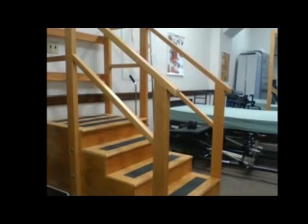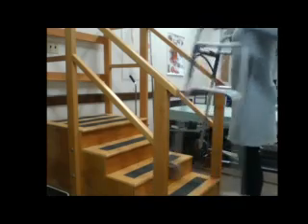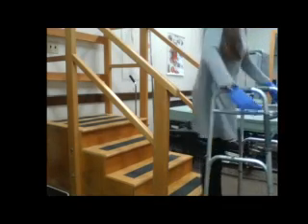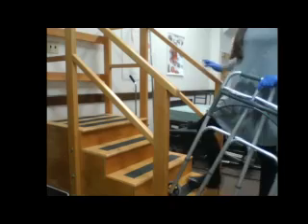Now, walker. Is it safe to do this with a walker? No. So, with the walker, we are not going to use it on the stairs. The book shows a picture with the walker being used this way. Still not very safe.